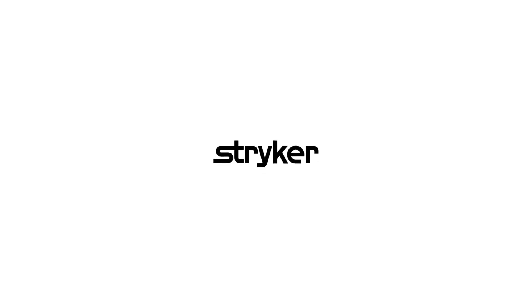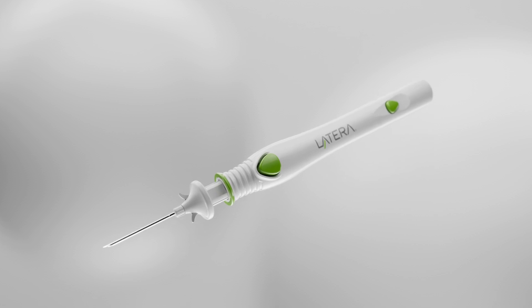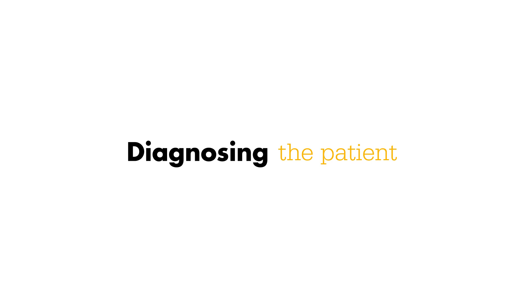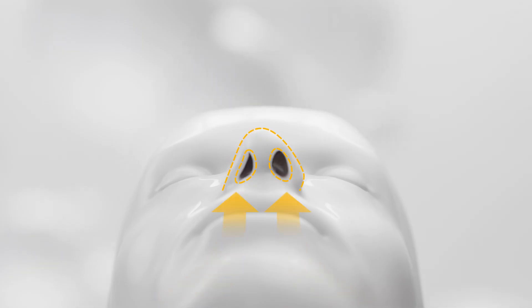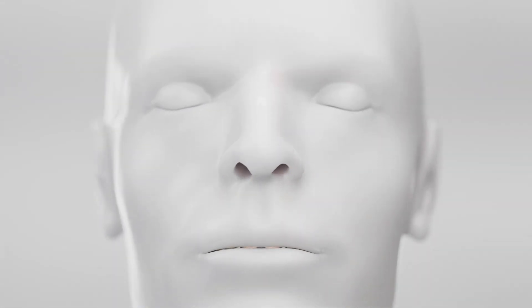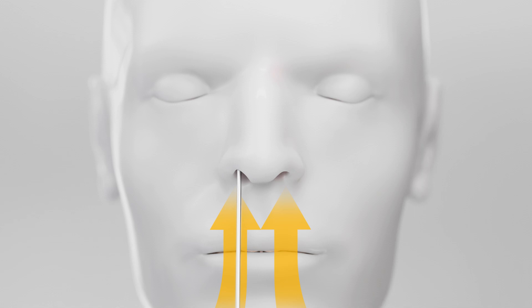Latera is an absorbable nasal implant that addresses a key factor of nasal airway obstruction by supporting the lateral wall. Upon inhalation, the nasal sidewall will collapse. Using a cerumen loop, the modified Cottle can be used to diagnose patients with lateral wall insufficiency. This acts as a support to the lateral wall, and there should be no change in appearance of the sidewall.